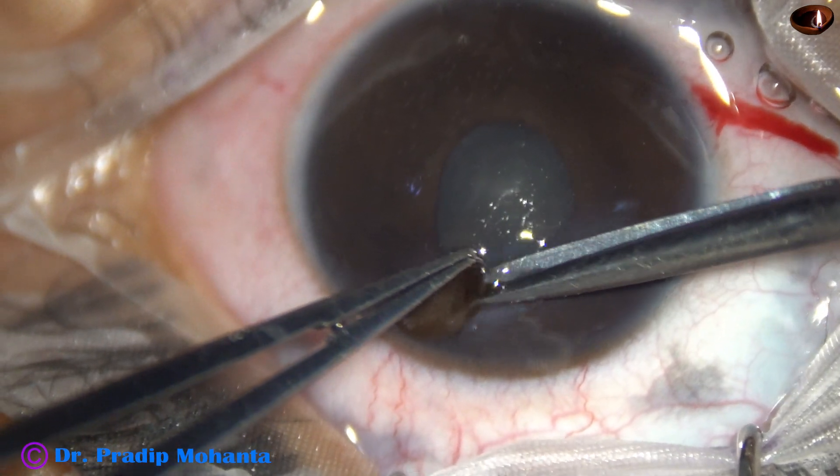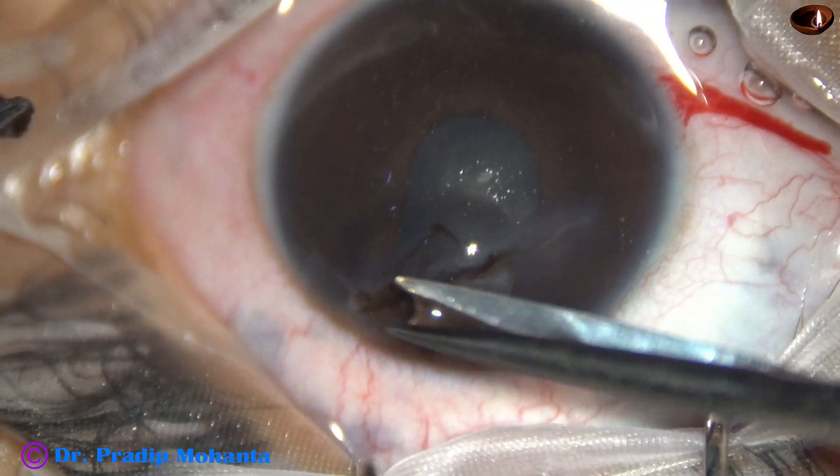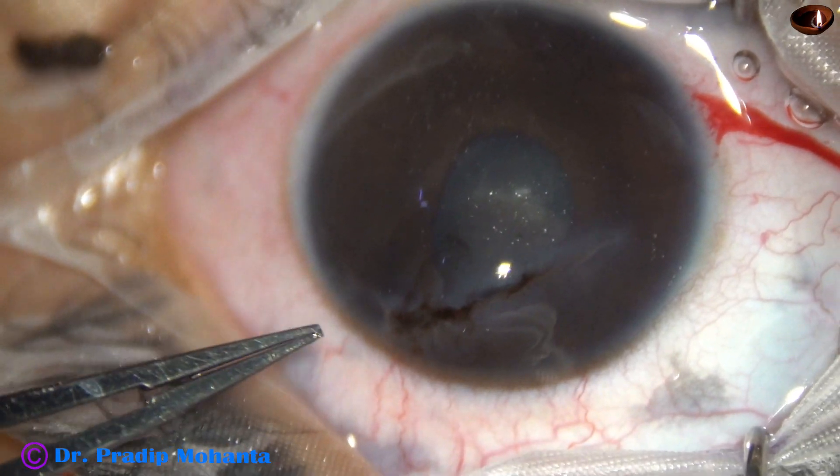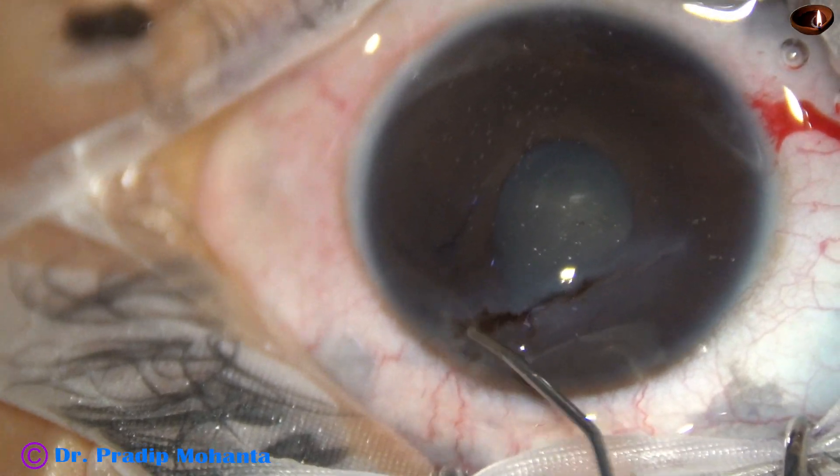Now I am abscising the iris that prolapsed out. This is moxifloxacin.